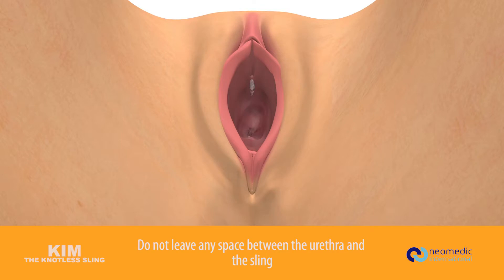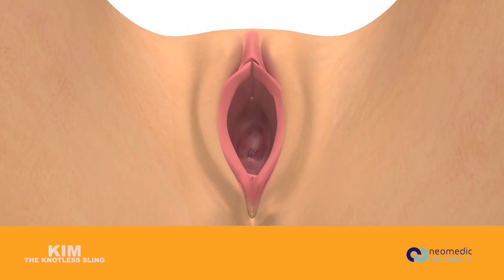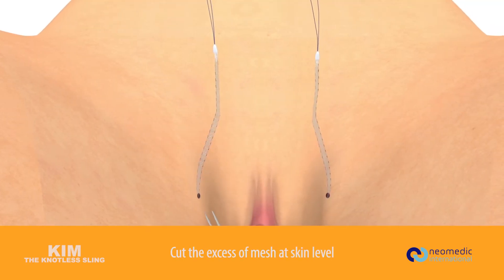Do not leave any space between the urethra and the sling. Close the vaginal incision. Cut the excess mesh at skin level.